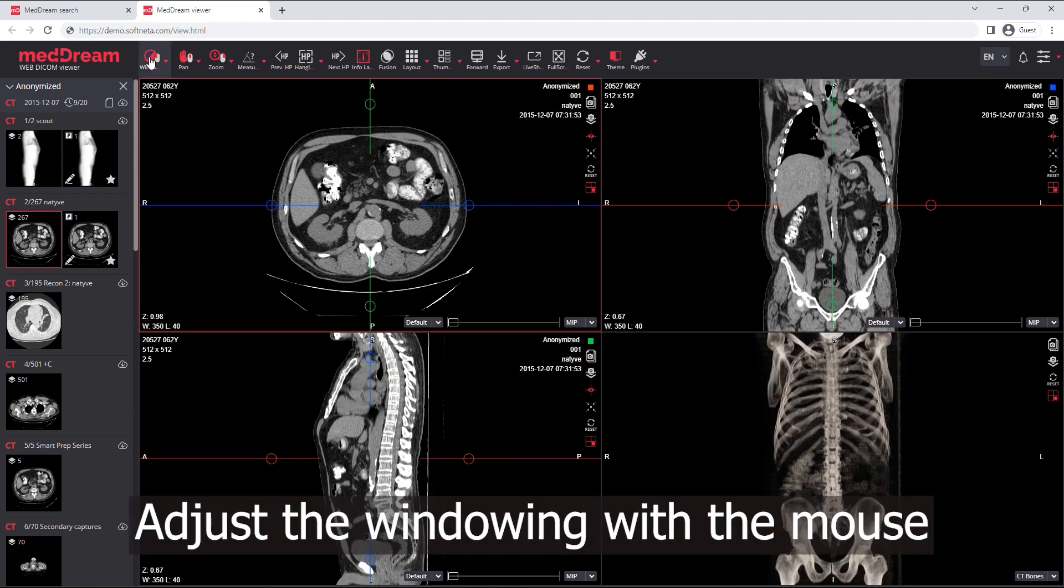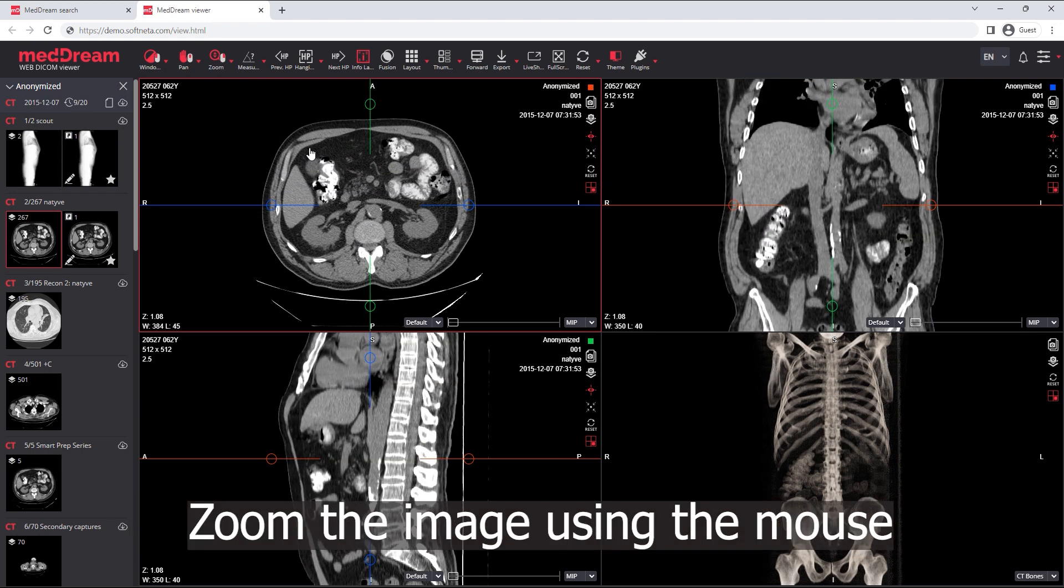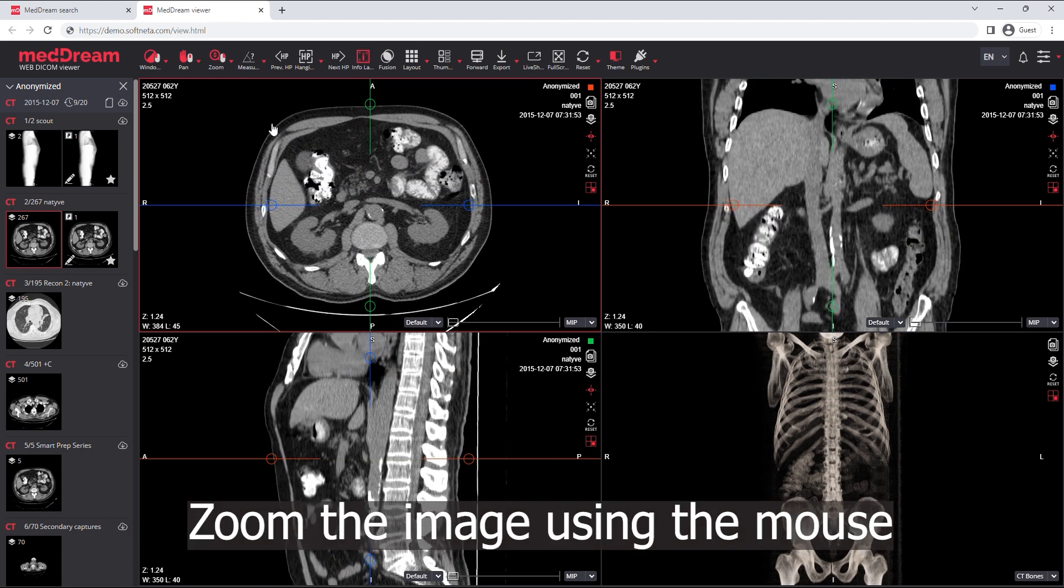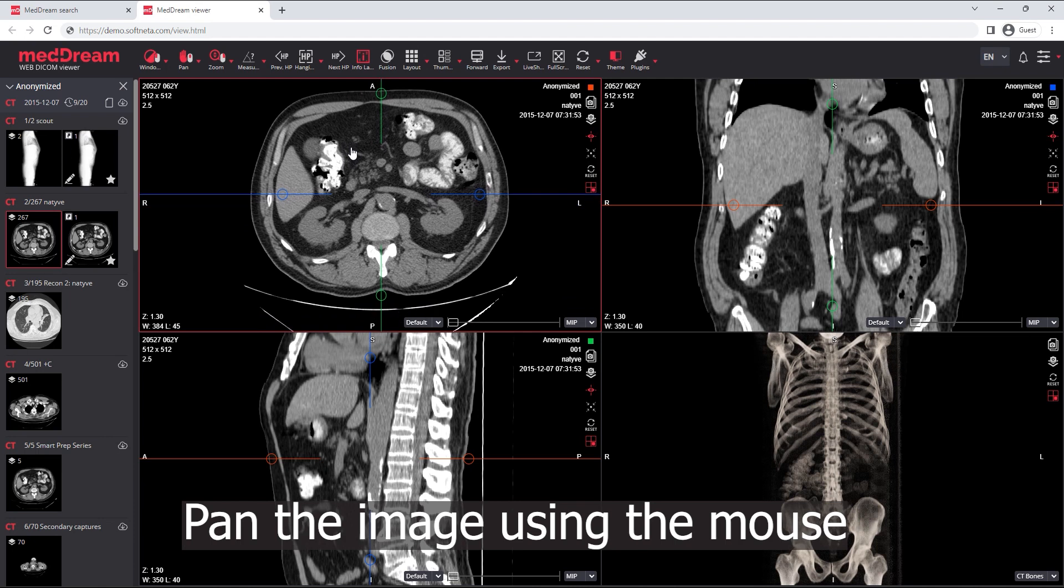Adjust the windowing with the mouse. Zoom the image using the mouse. Pan the image using the mouse.